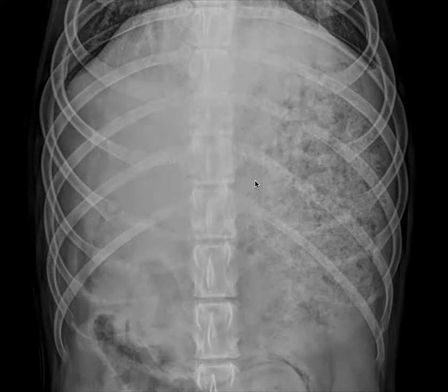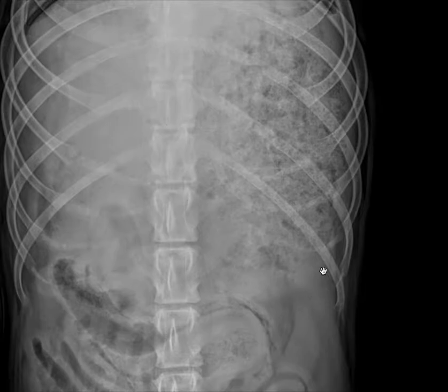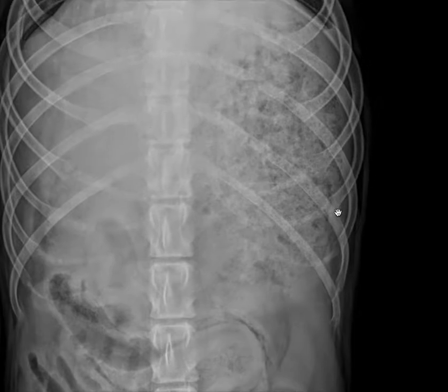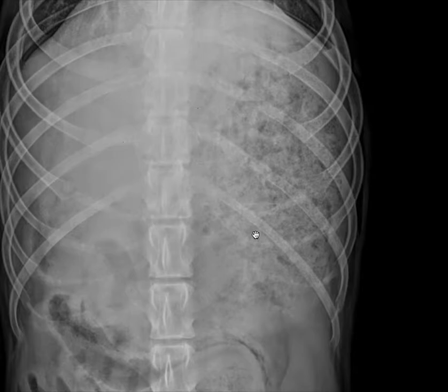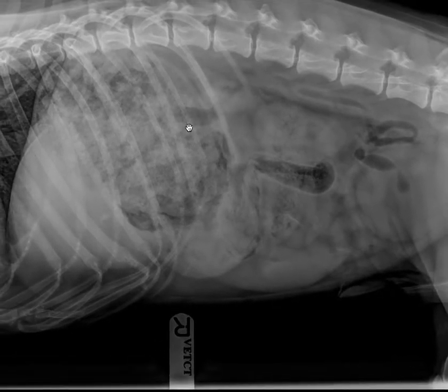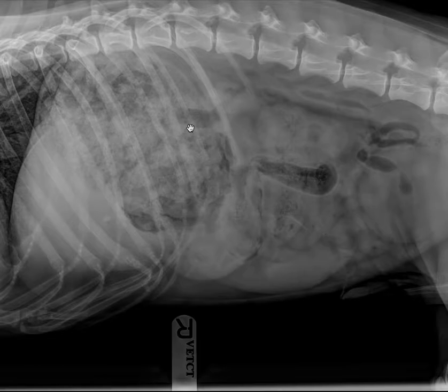Now let's start by acknowledging that it's clear there are substantial contents in this patient's stomach, so our job becomes to determine what the cause of this is. In a patient that hasn't eaten for days, we do not expect to see granular gastric ingesta. Because the stomach is large with granular contents, there are three categories of possibility to consider. The first is that this is a normal postprandial appearance of a dog that ate a large meal — this is probably not the case, provided the history given to us is accurate. So let's leave that aside for now.